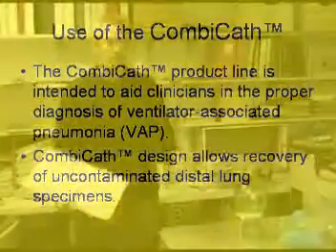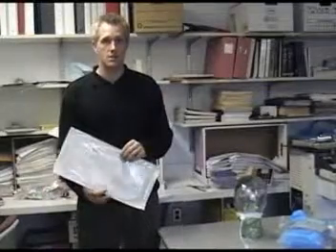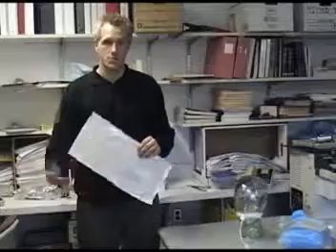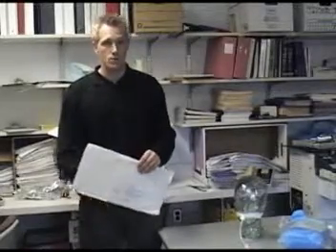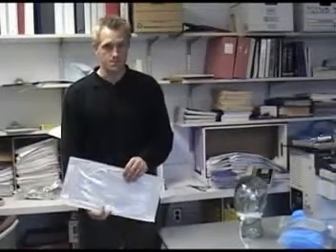Essentially, people have had issues with diagnosing VAP because the diagnostic tools have always been a little bit in flux. What a lot of people are doing is tracheal aspirates or sending sputum cultures down to the lab, which are notorious for having false positives, which leads to overtreatment of antibiotics, and also has a bit of a negative predictive value, which sometimes you can miss a bug because what you've got is a lot of upper airway contamination.